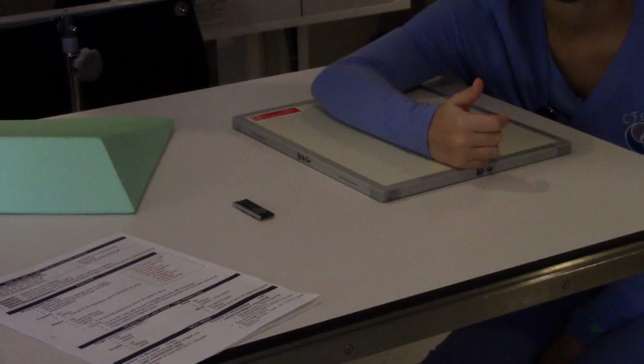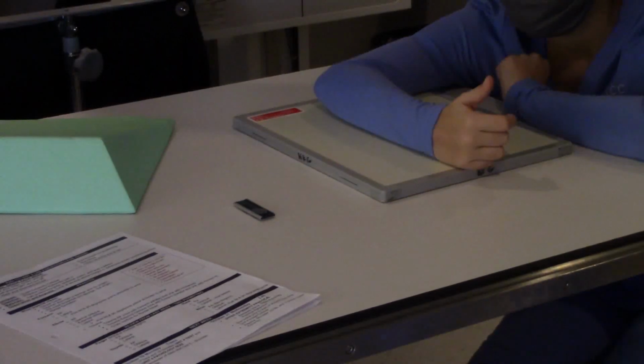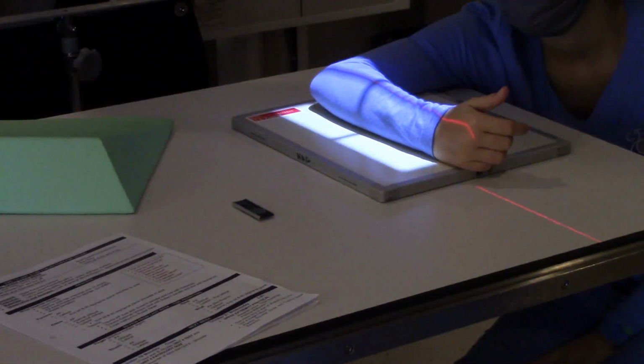As high as it goes? Yeah. Yep, that's all she wrote. Okay, so the table is as high as it goes. So what can we do with this patient? There you go. Okay, patient, can you slouch down for us?